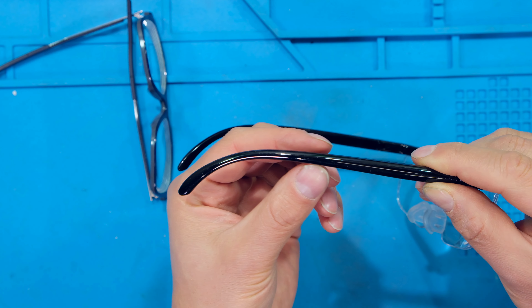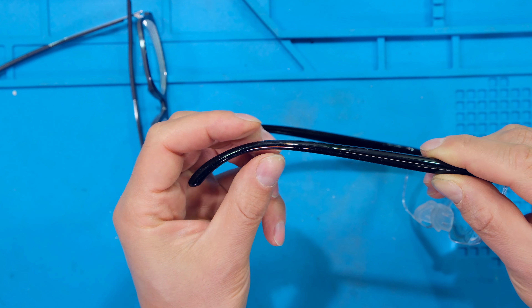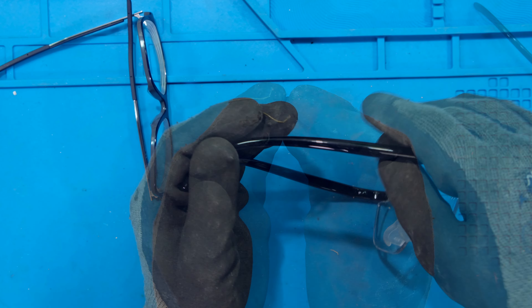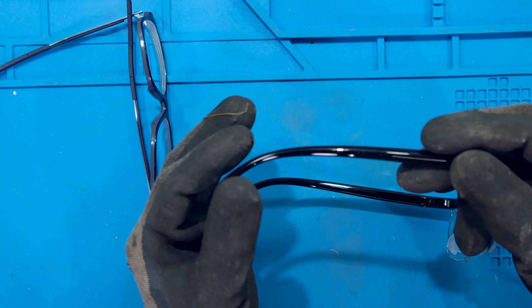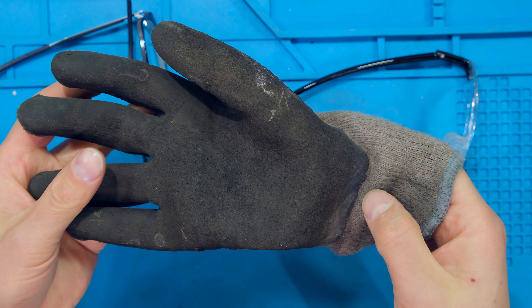Some temples use this type of plastic and if I put too much heat on here it actually deforms — if I put my finger there or hold it too tight you'll see it actually deforms, so you've got to be very careful. Because we're working with heat you can use gloves to protect your fingers, but because this plastic is so sensitive to heat, if it's too hot for my fingers it's also too hot for the plastic. In this video I'm not going to wear the gloves, but for safest practice one should always wear gloves.